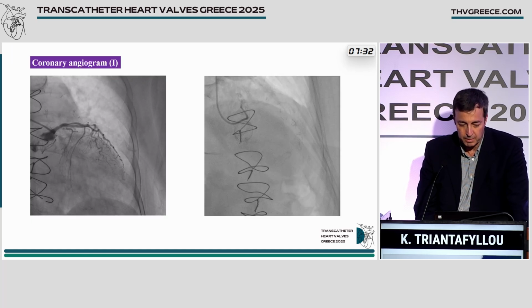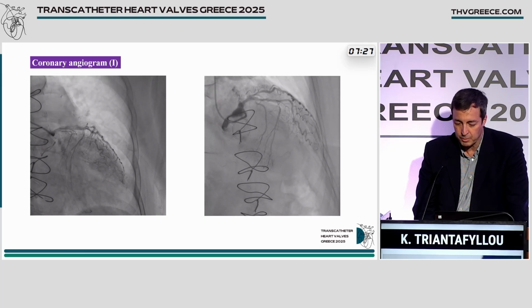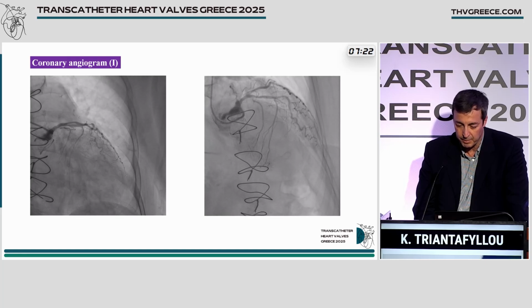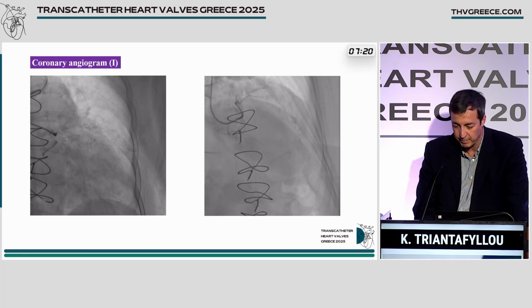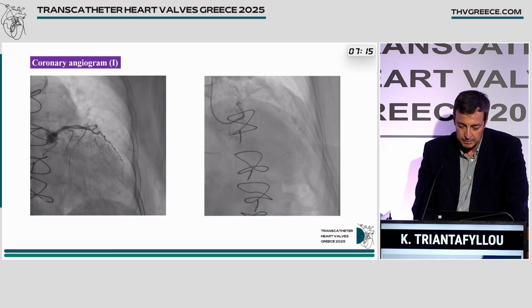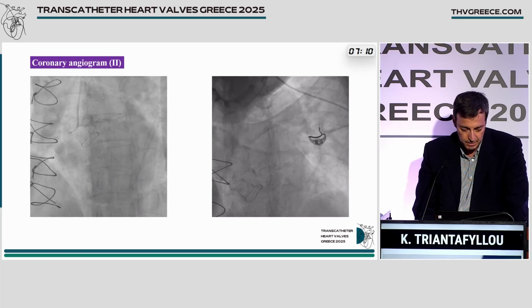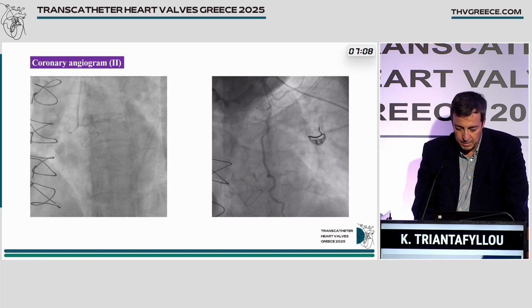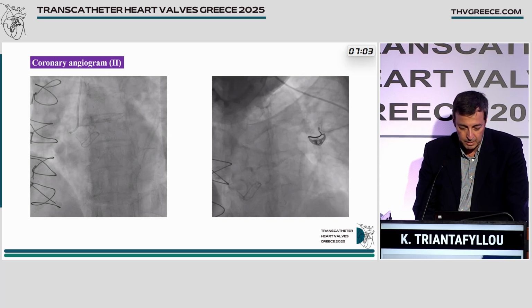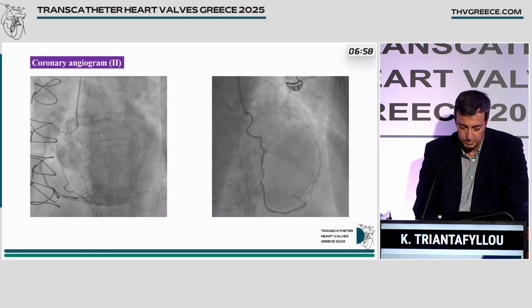So this is a coronary angiogram. This is the left system. There is an occlusion of the LAD, a chronic occlusion, just after a second large septal branch, which is mostly appreciated to the right. There is ostial occlusion of the circumflex and a large diagonal, which is somehow atheromatous but without severe disease. There is a patent LIMA which feeds the LAD and retrogradely the occluded circumflex, and the right coronary artery has no significant lesion.